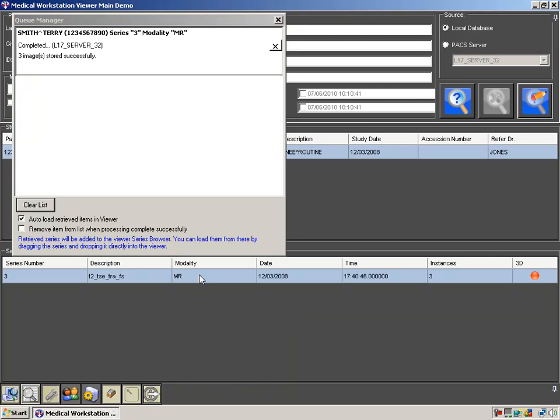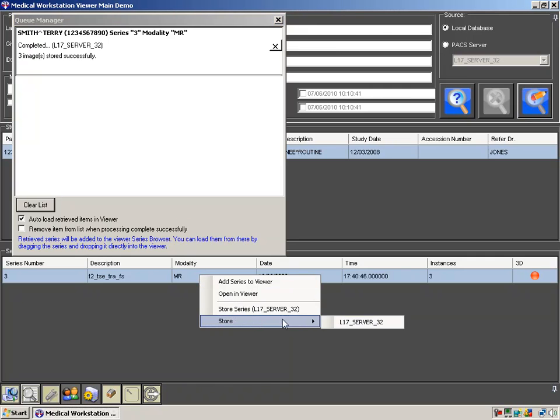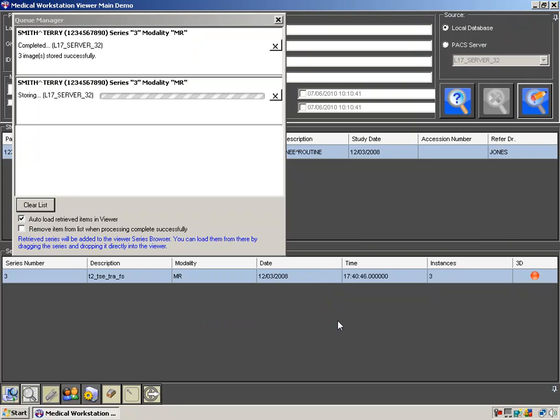Now, if we try to store the same series again to the same remote PACS, we will receive this error message: duplicate instance. This is telling us that the data set already exists in the remote PACS.